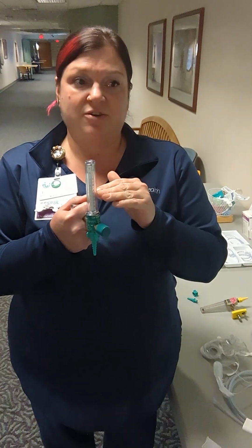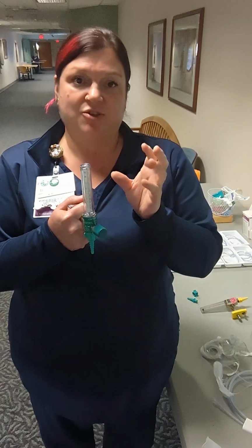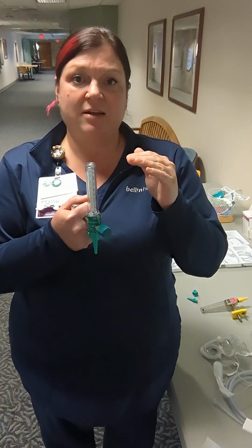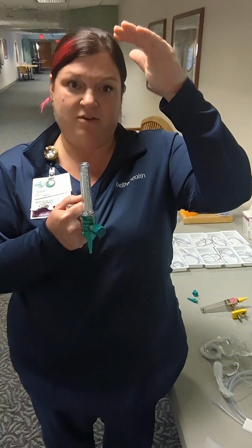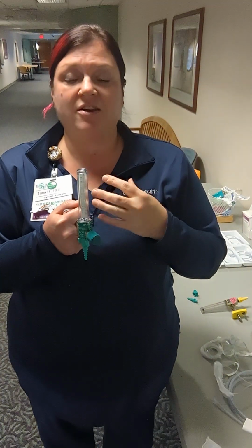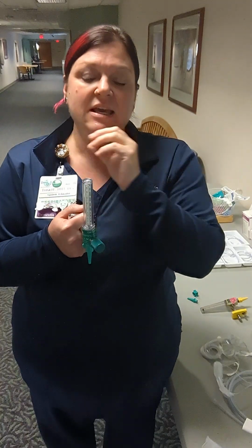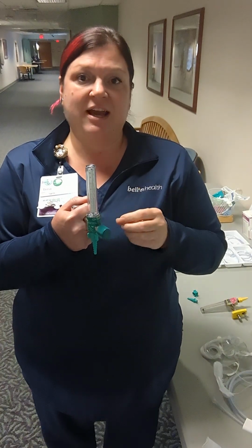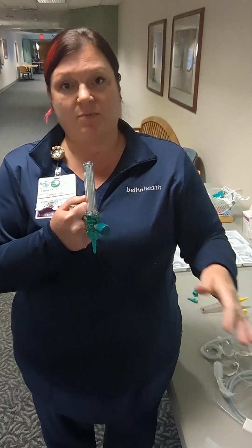We go to 2 liters, so we increase another liter, we add another 4%. So we bump up to 29%. Another liter, another 4%, another liter, 4%, liter, 4%. And that's why our saturations on the monitors, our O2 sats, are changing, because we're increasing the concentration of oxygen within the gas that we're providing.